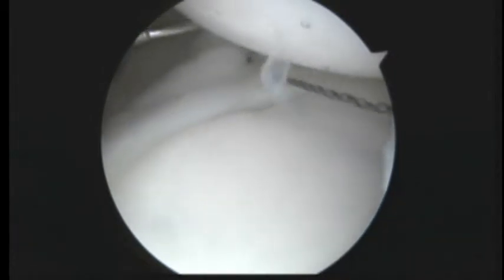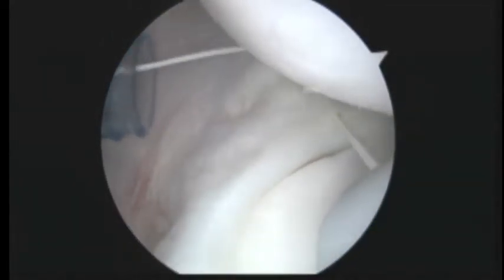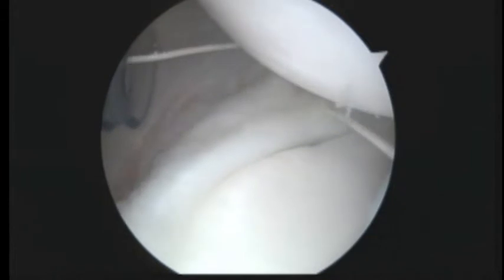Inside your shoulder, we're going to load that with a suture. Now we're going to do a particular type of stitch. This is called a figure of 8 stitch. And you'll see what that looks like in just a second here. Hold the camera, please. So now we've got half of that done.